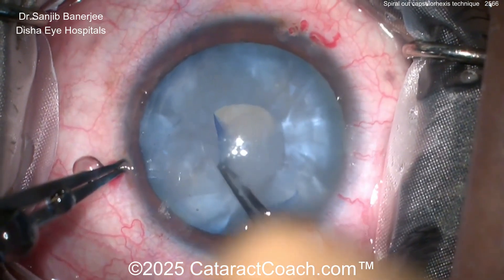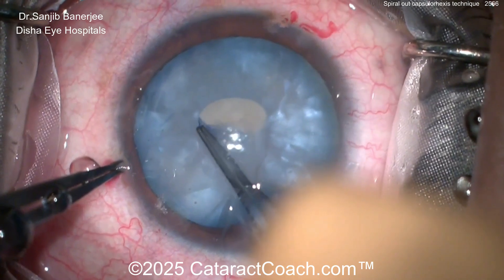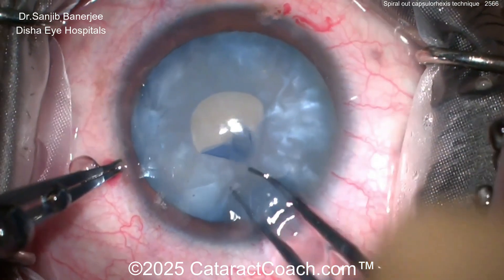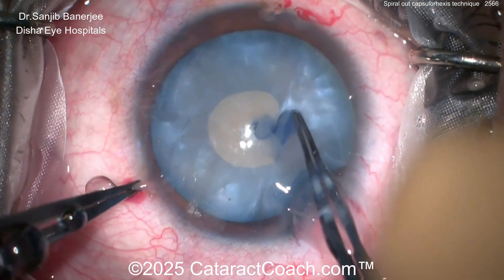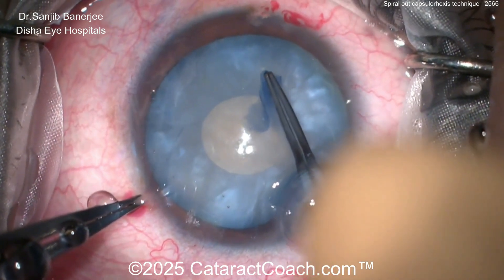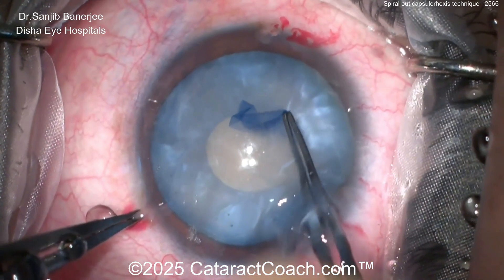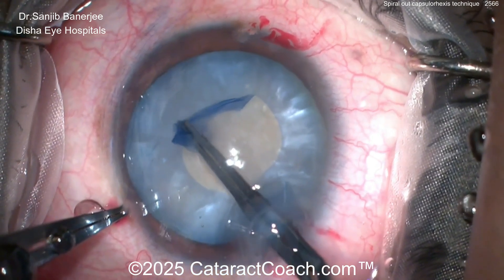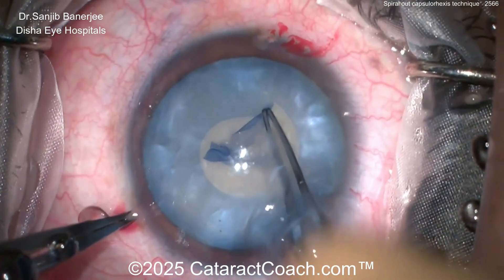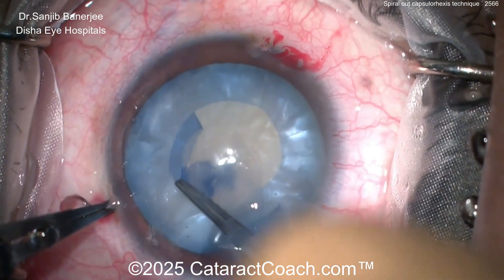A little bit of milk comes out, and then here you've got a baby rhexis. Now if it starts to run out, just quickly finish the rhexis and use the double rhexis technique. But if it doesn't run out on you — like here — just take your time and slowly spiral it out. At any time if it starts to run out, just pull centrally and you'll complete a baby rhexis, which can then be enlarged later after you decompress.